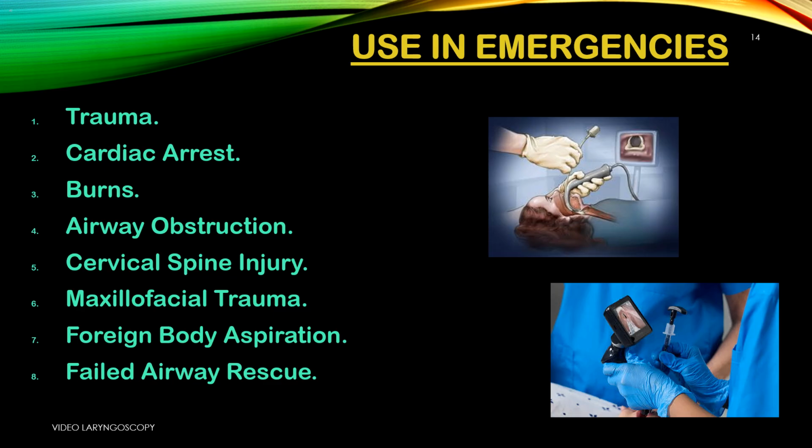2. Cardiac arrest. Every second counts. Faster first pass intubation means less interruption to chest compressions. 3. Burns. Facial and airway swelling can make intubation hard. VL helps visualize before edema worsens.